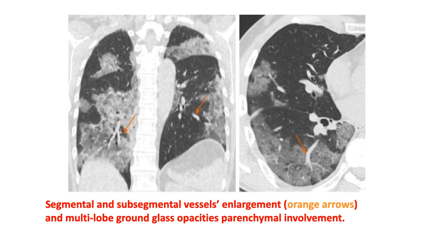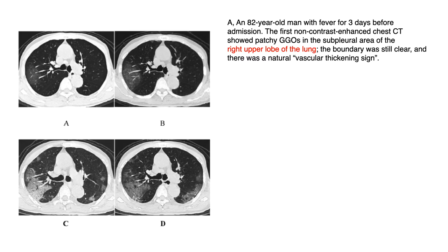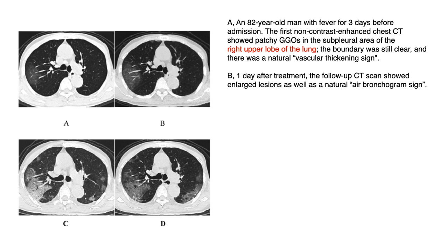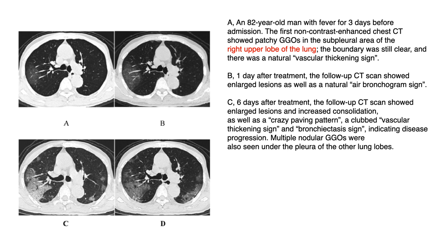Another atypical presentation: segmental and subsegmental vessel enlargement with multilobar ground glass opacities — mainly parenchymal involvement. As discussed, distribution should generally be peripheral, but here we see central parenchymal involvement, which is atypical. An 82-year-old man with fever for three days: initial CT showed very thin ground glass opacity in the subpleural area on the right chest. One day after follow-up CT showed enlarged lesions with air bronchogram sign — prominent bronchus within the ground glass opacities.